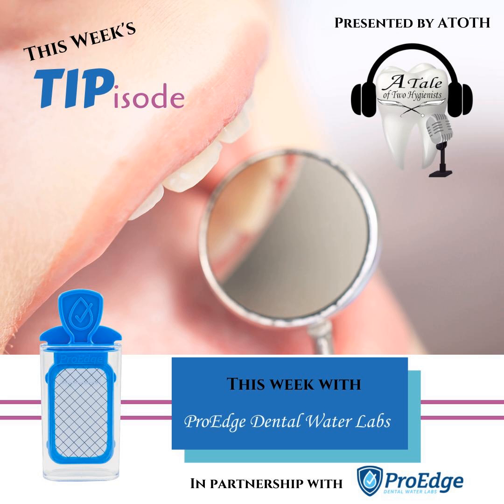The state of Washington, which will require water testing every 90 days this year in December, says that combined samples are okay. It's an approved method. OSAP says so too. I think even the 8X instructions for you say take a combined sample from each. So it's becoming more and more legitimized in the industry. It's becoming a standard practice. Okay, so combined samples.